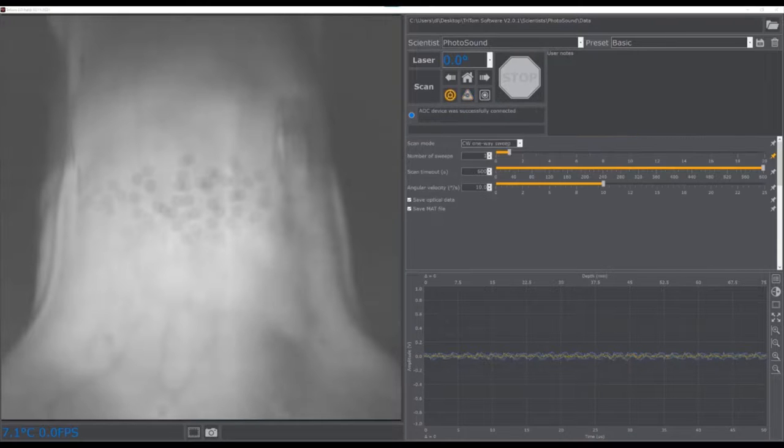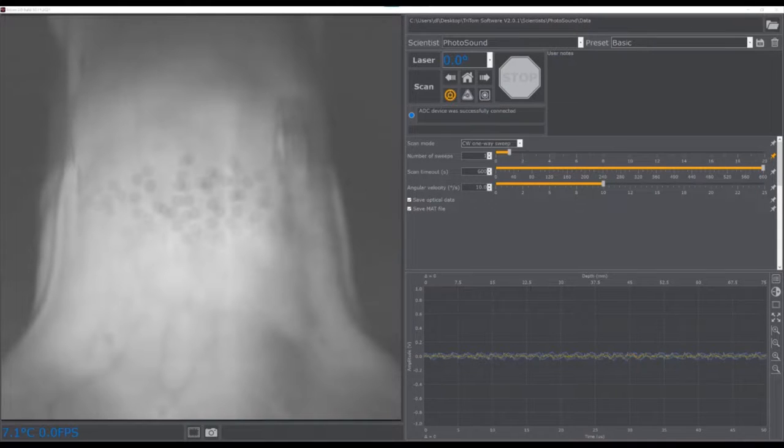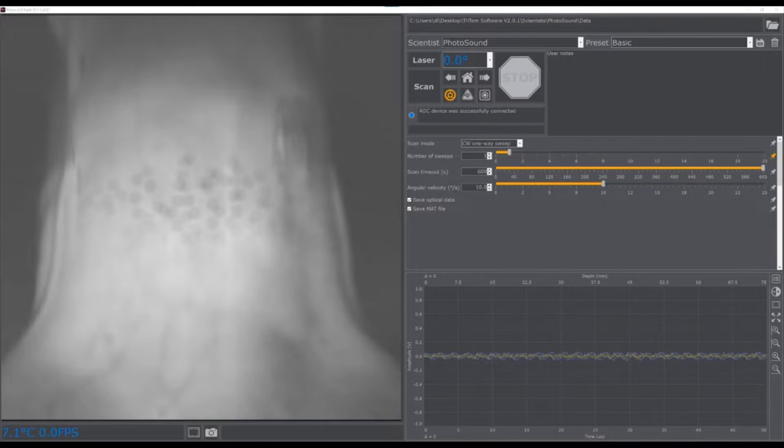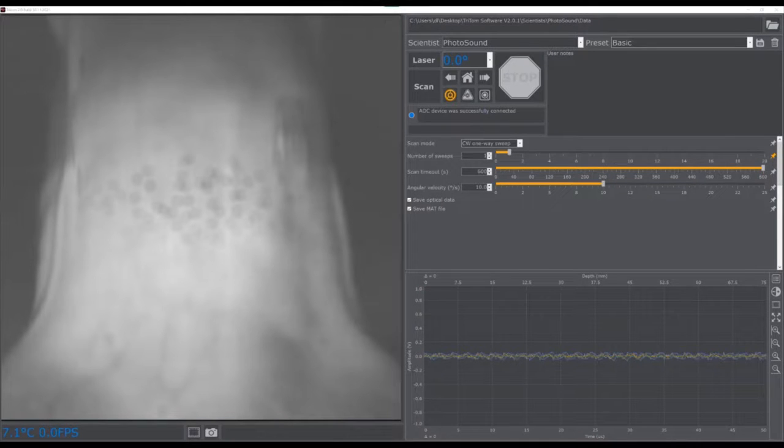Next to the laser settings is the scan settings menu that contains options for the direction of rotation for the scan, the scan timeout, angular velocity of the rotational motor, optical data save option, and an option for converting the saved scan data to a MATLAB file.